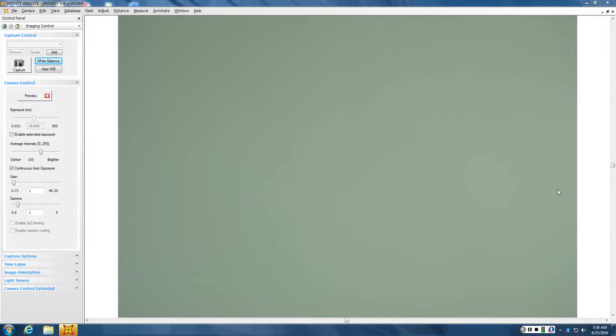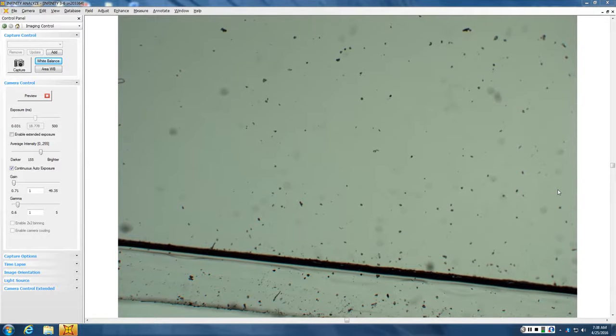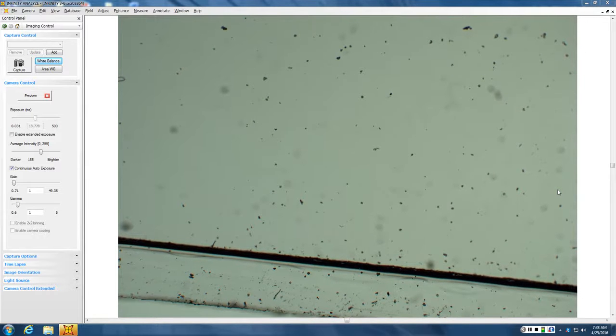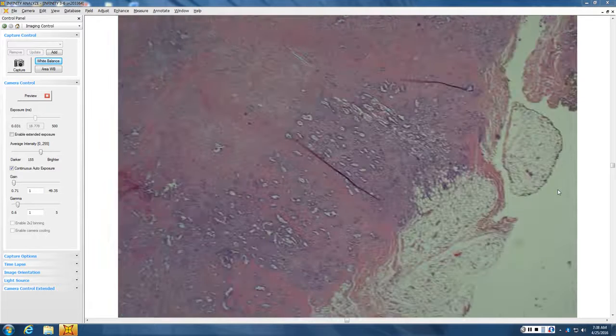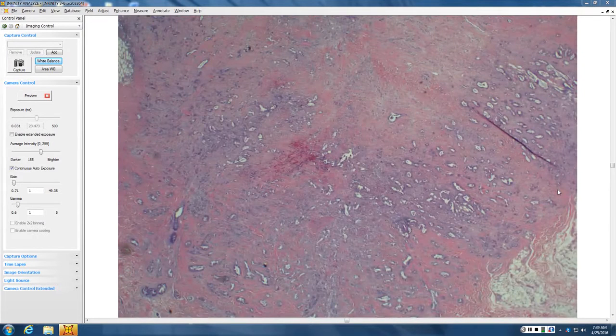Let's go ahead. We are going to zip through the metastases, and then we're going to do some potpourri from the beginning of the year, because we have hit everything, so you know everything. So all diseases of mankind.